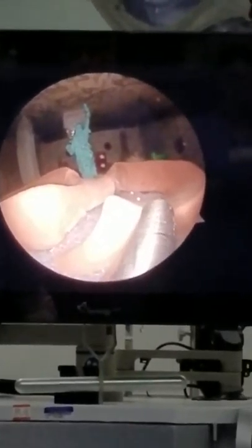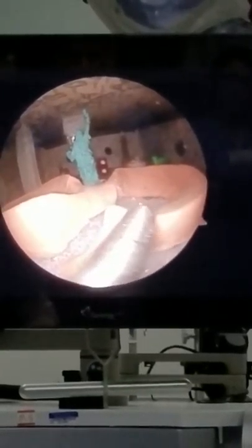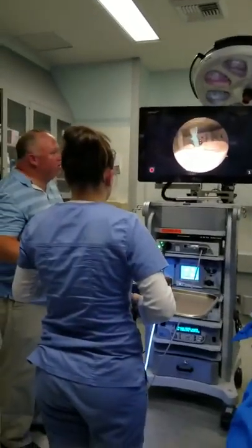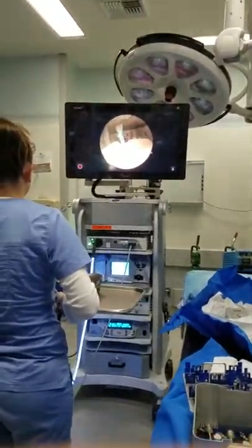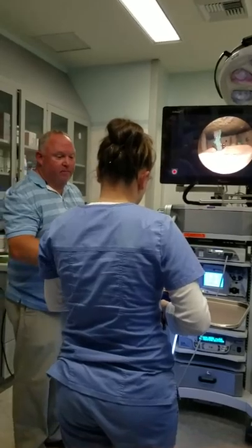And they're going to work with a shaver in this hand, and they're going to use a shaver in the other hand. They're going to move the one hand and use the shaver. They're going to try to trim things or cut things. So that kind of represents the knee the best they can get in a fake form, in a box. Okay? That's the idea. Cool. Not too bad. Okay. What's next?